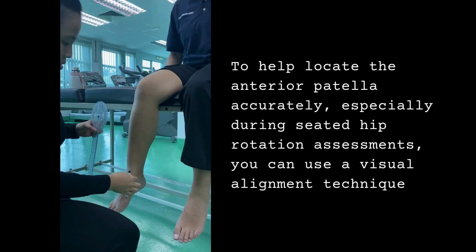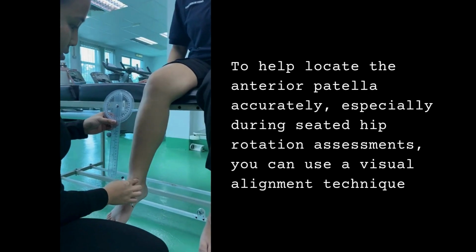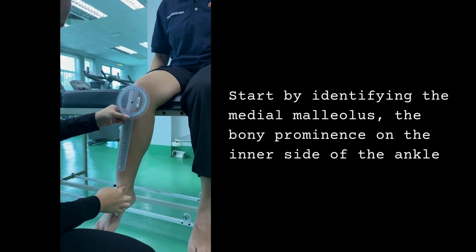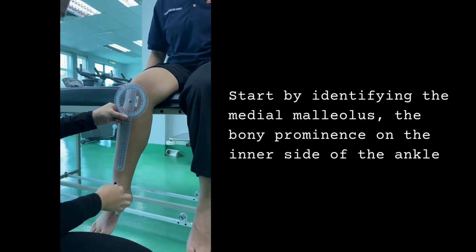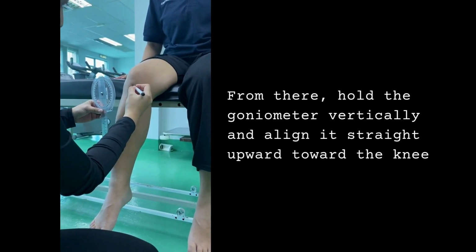To help locate the anterior patella accurately, especially during seated hip rotation assessments, you can use a visual alignment technique. Start by identifying the medial malleolus, the bony prominence on the inner side of the ankle. From there, hold the goniometer vertically and align it straight upward toward the knee.